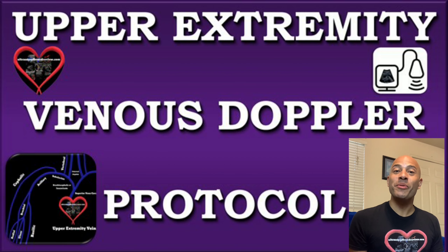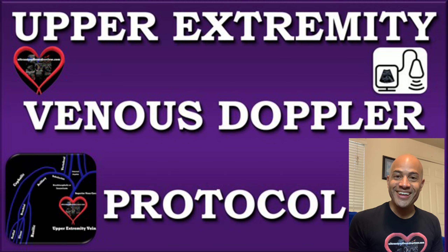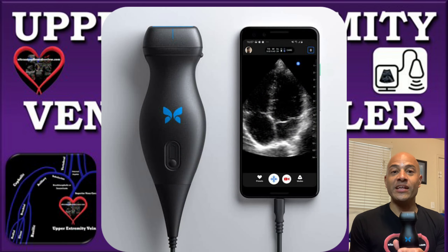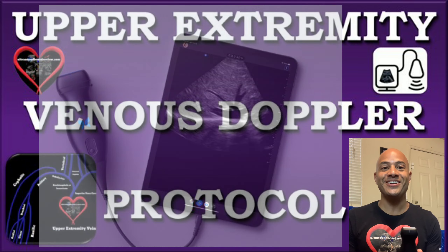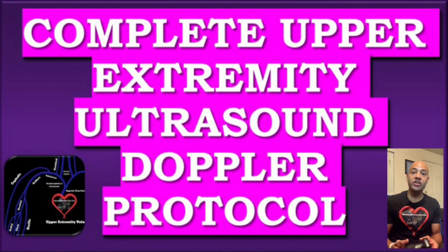Welcome to our upper extremity ultrasound Doppler protocol. I'll be demonstrating this tutorial with my handheld portable high quality transducer probe — the Butterfly IQ transducer. We'll begin by taking images of the IJ.